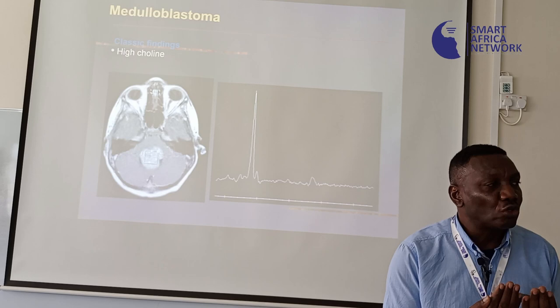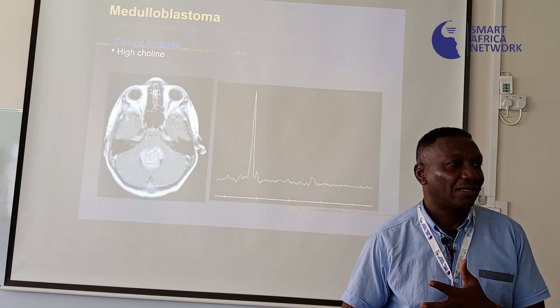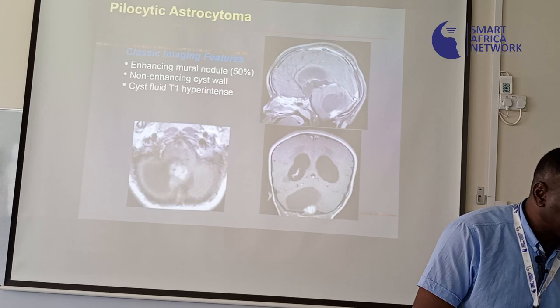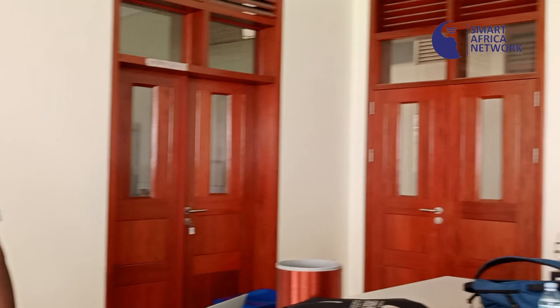Because sometimes tumors can look alike. And we're not able to know whether it is benign or malignant. So spectroscopy can help you because the ratio of certain of these metabolites in malignant tumors is different. So spectroscopy can give you an idea of the various tissue components. So we can look at the enhancement of tissues, the shape of tissue, and the constituents of tissues with MRI. And the beauty about MRI is that sometimes you can do certain tests that help you correlate with genetic markers in patients. So there are several tumors, but like I said, you need to look at several parameters to be able to tell where they are. Okay?